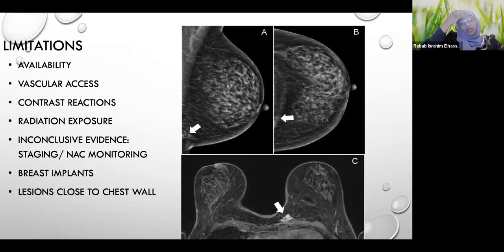So if we do contrast enhanced mammogram and I biopsy an area 5 centimeters from the original tumor, that's a multicentric disease and end of story. So we do use it regardless. For neoadjuvant chemotherapy monitoring, we still use it. It's not the gold standard. MRI is still the gold standard, but some ladies cannot undergo MRI.